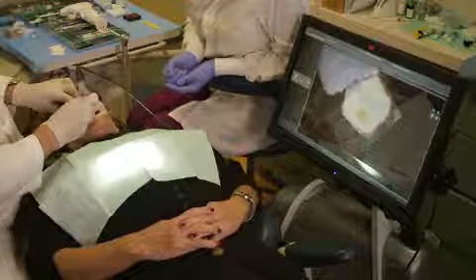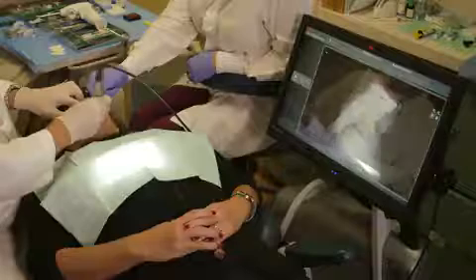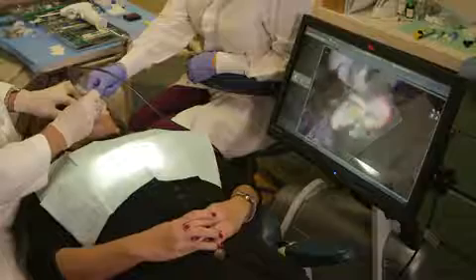We have a very good patient here — he's sitting real still. But most patients don't mind. This process is significantly shorter overall than it would be to do rubber impressions. It's really surprised me in the sense that it's improved my efficiency and my accuracy.